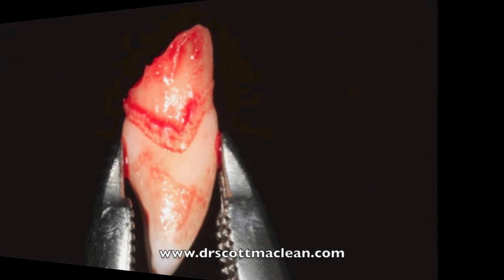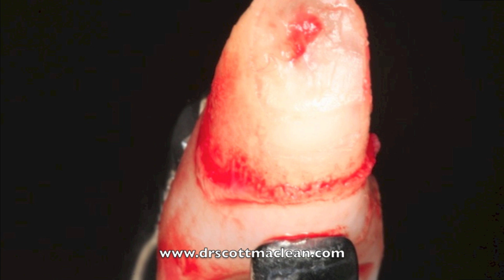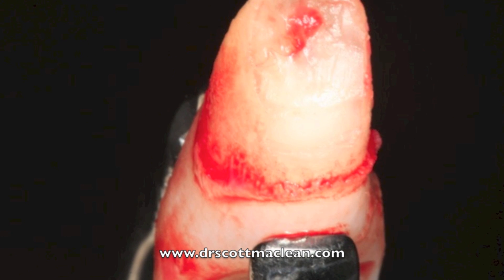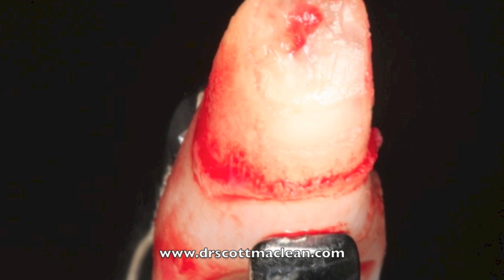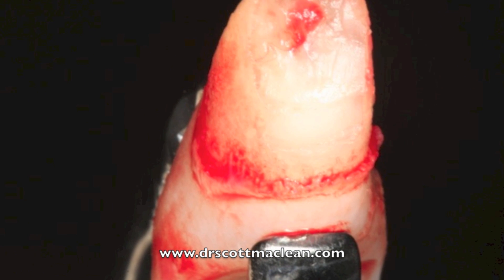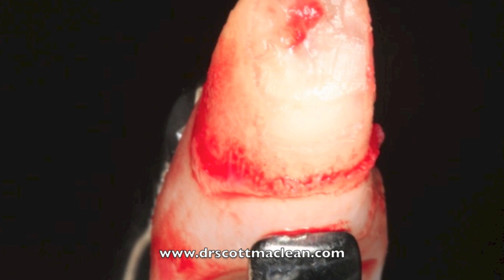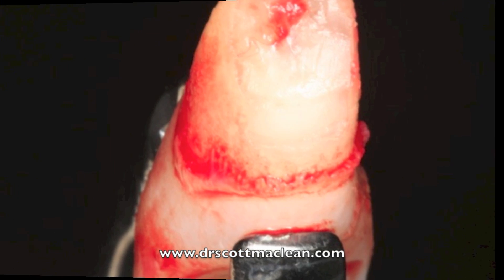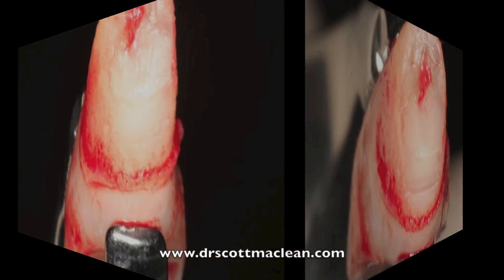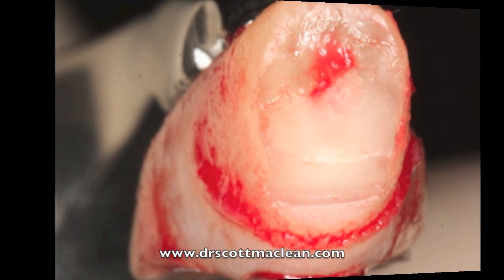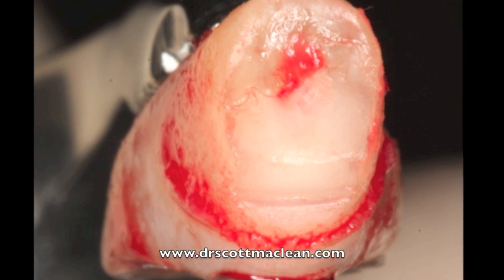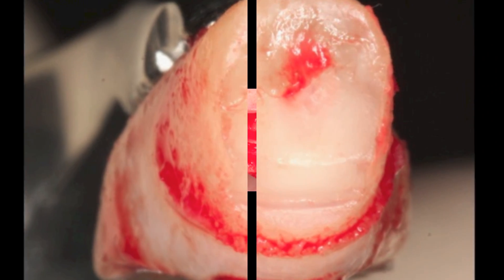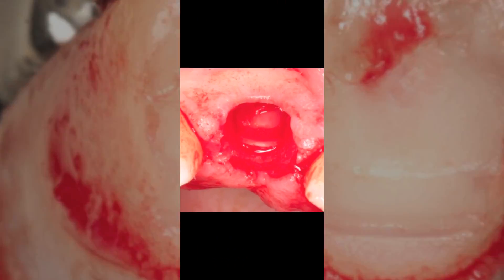If we have a look at the end of the tooth — where the tooth fracture is — you can see it's a kind of an oblique type of fracture into the pulp. So this part of the tooth came out quite easily, but you can see that the root is a bit more challenging.